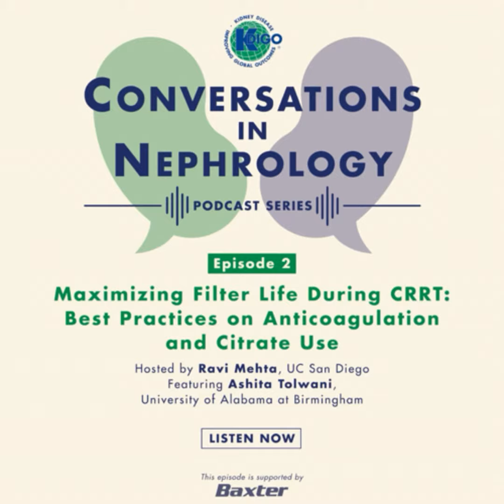effects. Now, when you're really choosing an anticoagulant for the patient, it should be individualized. It should be based on not only the patient's condition, but also the availability and expertise at the institution. So essentially, you really need to focus on safety of the patient. So patients who cannot tolerate anticoagulation because they have a high risk of bleeding, regional citrate anticoagulation, if you have the expertise, would be preferred.